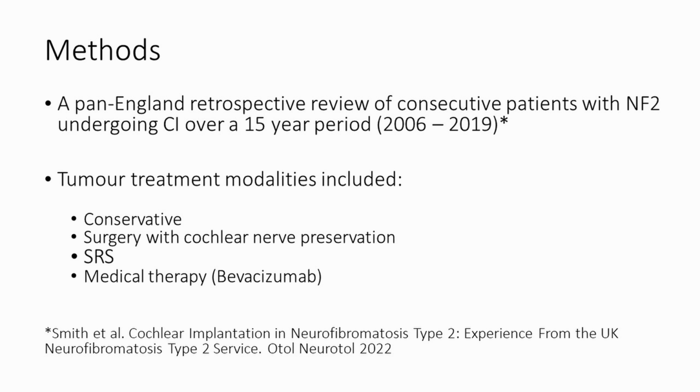So we've recently completed a review of the UK's cochlear implant experience, and it's the largest in the world. We've got 64 patients with cochlear implants in NF2. And we've essentially got four groups of patients. We've got those that have had their vestibular schwannomas treated conservatively, so no surgery or radiotherapy. Those that have had surgery but have had their cochlear nerves preserved. Those that have had radiotherapy. And then those that have been treated medically with bevacizumab.